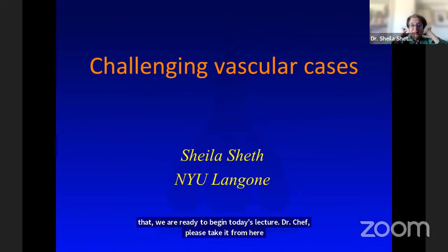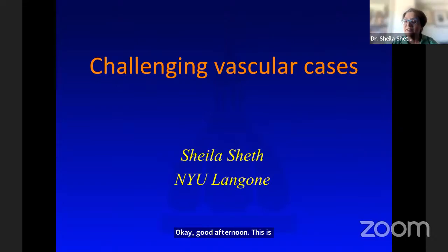Okay, good afternoon. This is afternoon in the United States, in New York City, where I am. I hope everybody can see my screen. This is going to be a case-based talk. I gave a similar talk to our fellows in the body imaging section yesterday, because I think sometimes it's easier to learn that way. So just look at the cases and challenge yourself. Let's get started.